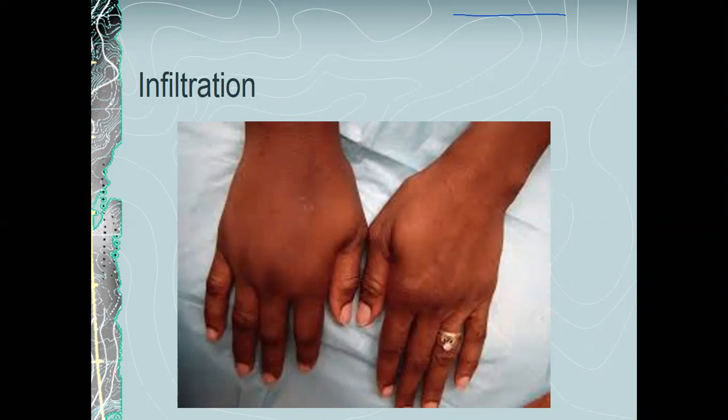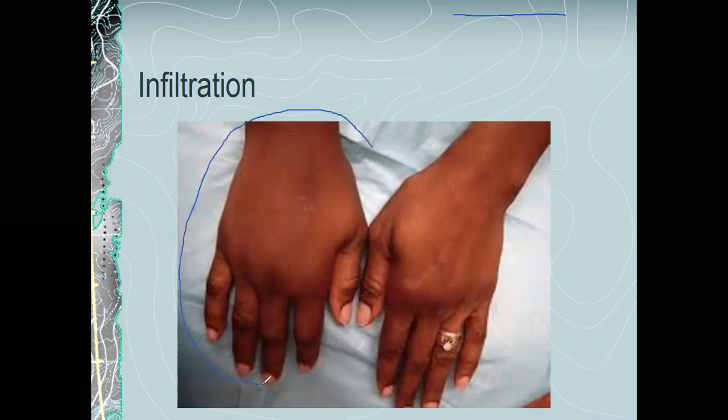So what you'll assess and see in the patient is the site will be swollen, edematous. Usually it's cool to the touch because it's got that fluid in it, and that fluid is less than your body's temperature. So it is going to be cool to the touch, and then sometimes leaking around the site. First thing to do if you suspect infiltration is to stop the IV infusion. You see it, you suspect infiltration, stop the IV infusion.